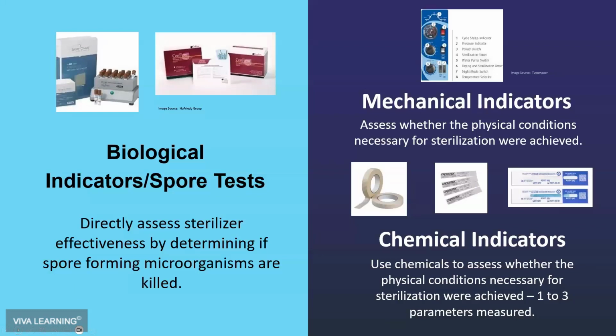One of the things that the AAMI standard that we're going to talk about in a bit says is that if you have an older style sterilizer that does not give you a readout at the end of the cycle, then you shouldn't use that sterilizer. You either need to get a special unit that you can attach onto your sterilizer that is a separate little printer, or you purchase a sterilizer that gives you that information. So you've got documentation that that particular load met all the parameters.